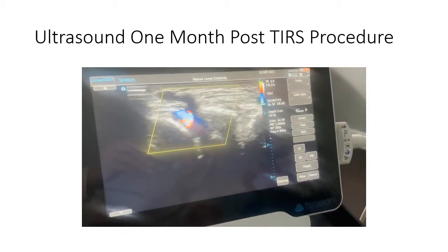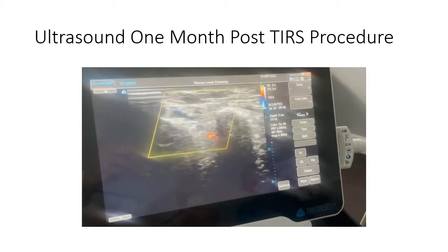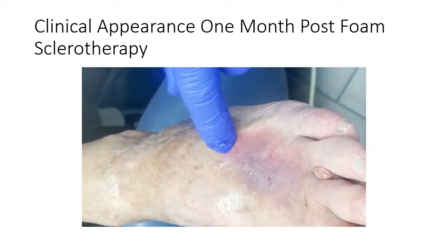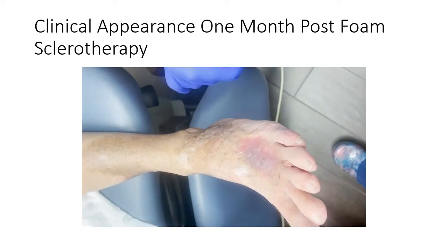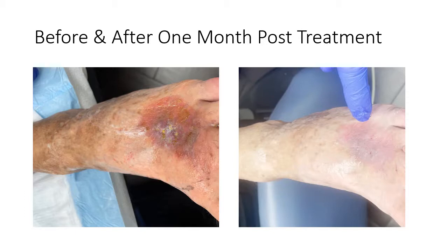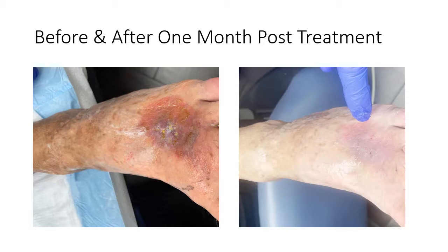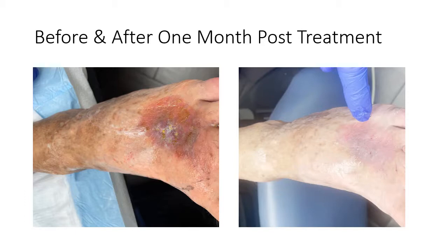Today we're going to close off the greater saphenous vein, but this is a nice result. That vessel up here is occluded. These are the digital vessels right here. You can see here there's complete healing of where the ulcer was. This is one month post-TIRS procedure. You can see the decrease in inflammation and the healing of the ulcer. This is an excellent response — what we would expect in these small ulcerations. Larger ulcerations will take a little bit longer to heal, another month or two. The patient was pain-free within about four days of the procedure.